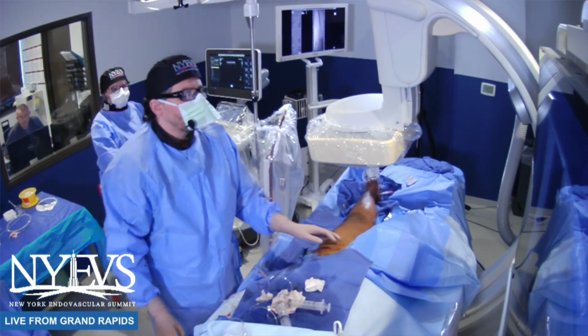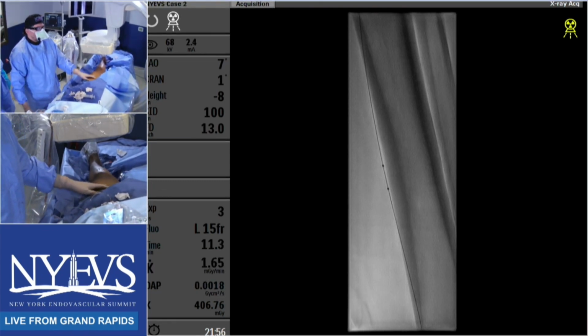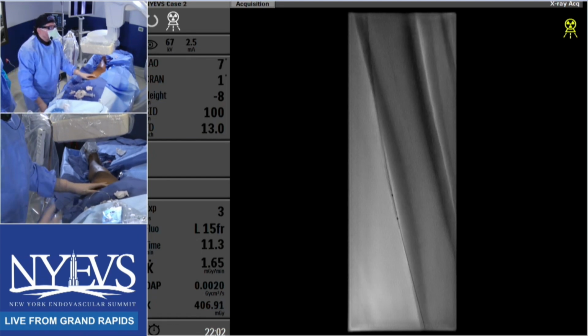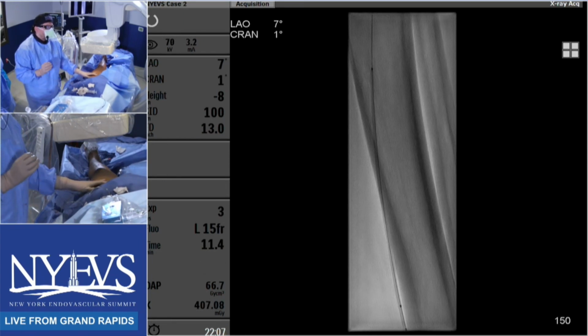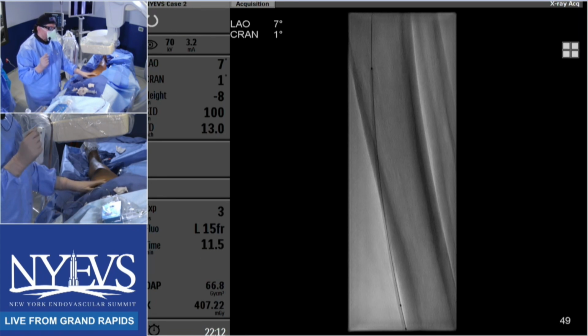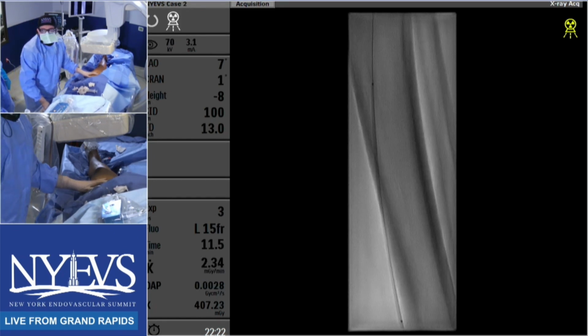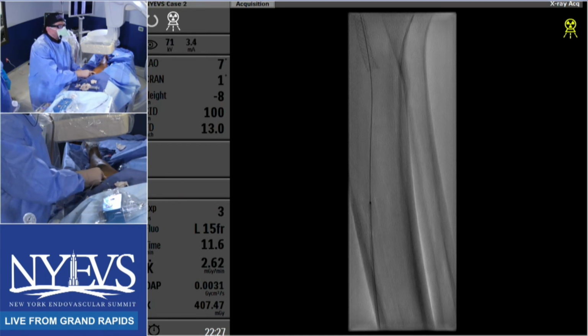I am pre-dilating the vessel because I was not able to advance the IVUS catheter with a 2.0 balloon. I do that before IVUS. Even if I'm subintimal, I don't think I'm subadventitial just because of the ease of crossing. And I'd rather do that than deal with a complication by pushing a device like the IVUS catheter, or any device, or even the laser if I want to do it here, and have a complication there. So I think it's less likely for me to have a problem in this patient here. That's why I'm pre-dilating in this patient.